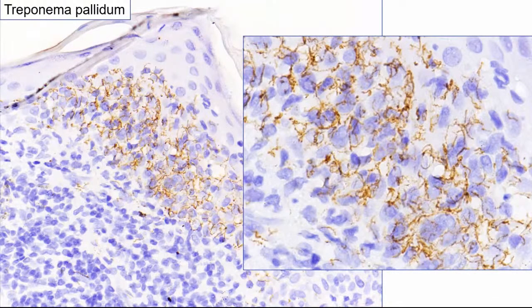And it turns out that there are numerous treponema here, seen best in the epidermis in these images, just innumerable within the epidermis. So this is an example of syphilis. And given the distribution of the lesions, we'd expect this to be secondary syphilis. So not MALT lymphoma, easily cured with antibiotics, I think, but important to get the diagnosis right.